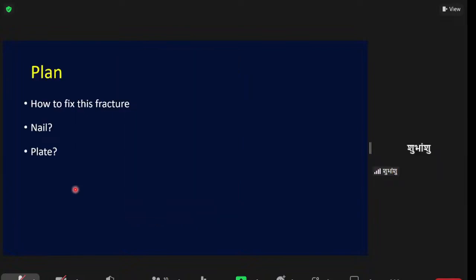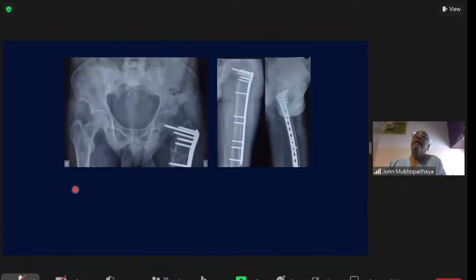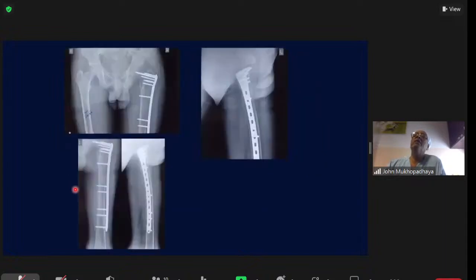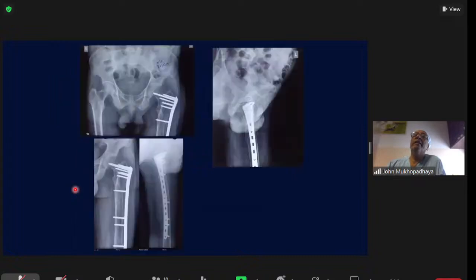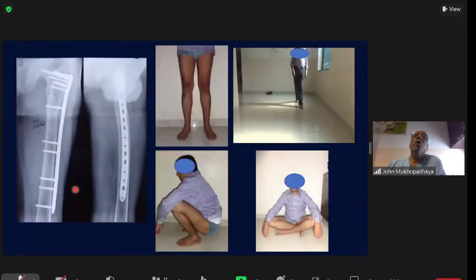So we put you on the fracture table, and what we did was we put this locking plate. We were able to go just beyond the last bit of the lytic lesion, with multiple screws in the proximal part. As you can see, with time, the bone quality doesn't come back to normal straight away, but over time you can see how the bone is reforming. Finally, it is almost normal. The cortices are reforming, and finally it has healed nicely.